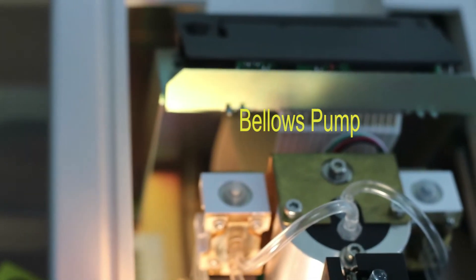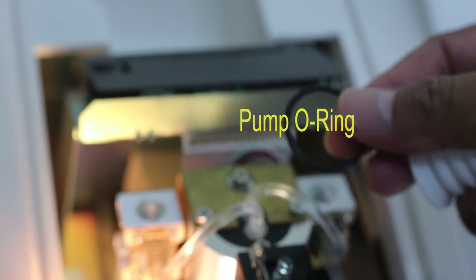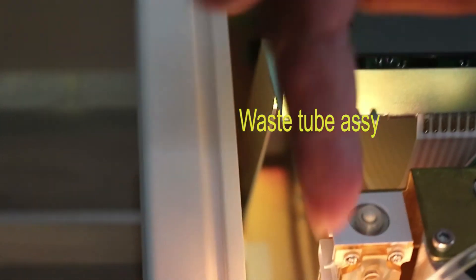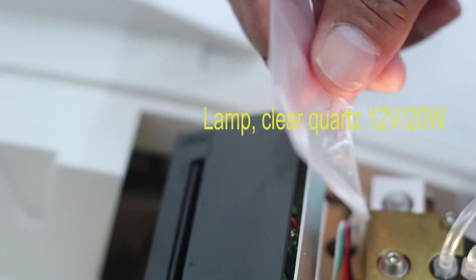Pada Bellows Pump terdapat dua part lagi. Yang pertama adalah Bellows, dan yang kedua adalah o-ring. Selanjutnya adalah waste tube atau selang pembuangan yang terdapat di bawah, yang menghubungkan antara outlet dan arah keluar dari saluran pembuangan. Dan yang terakhir adalah lampu, halogen lamp, yang posisinya di dalam cover kuning.